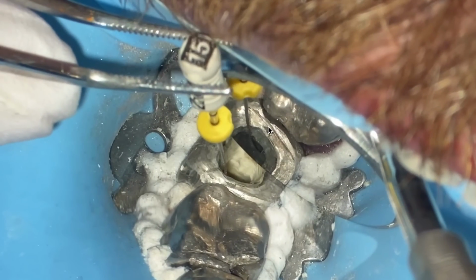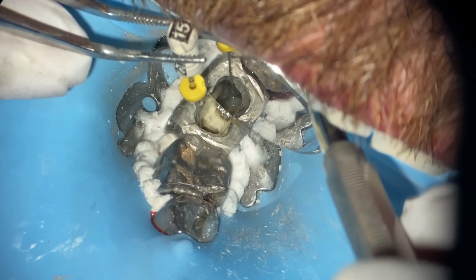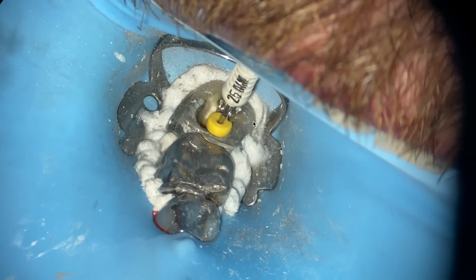Now, what you can do is remove all of this restoration. If you want to make life much easier, remove all that restoration, and then boom. So I can use my mirror and I can place my file in without any problems.